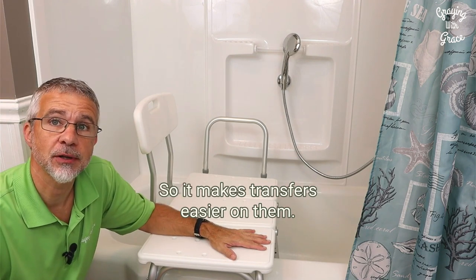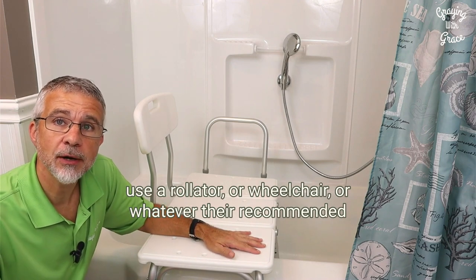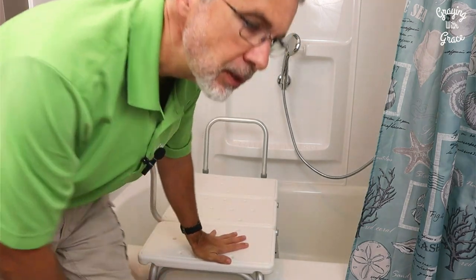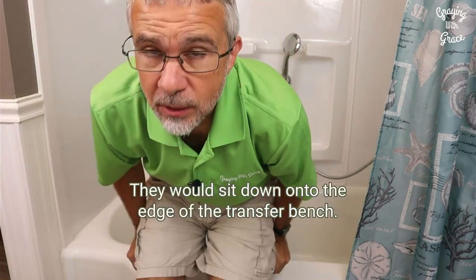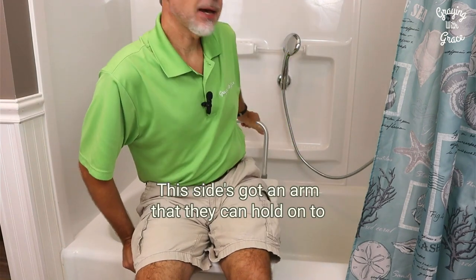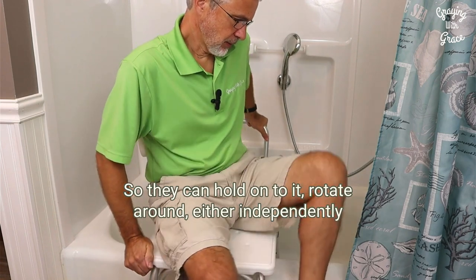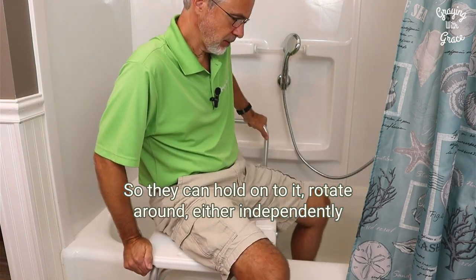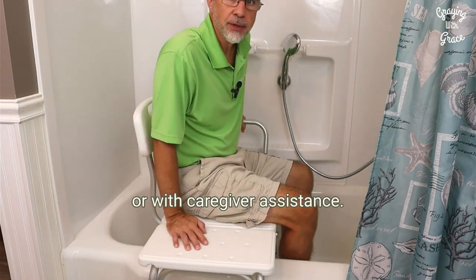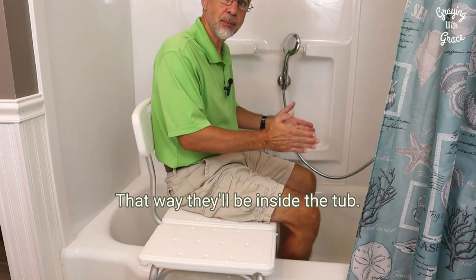Once you've got that in position you also want to set the height for the user properly, so it makes transfers easier on them. When they're ready to use it, they can either walk over to it or use a rollator or wheelchair or whatever their recommended mobility equipment is. They would sit down onto the edge of the transfer bench. This side has an arm that they can hold on to stabilize themselves, so they can hold on to it, rotate around, either independently or with caregiver assistance.